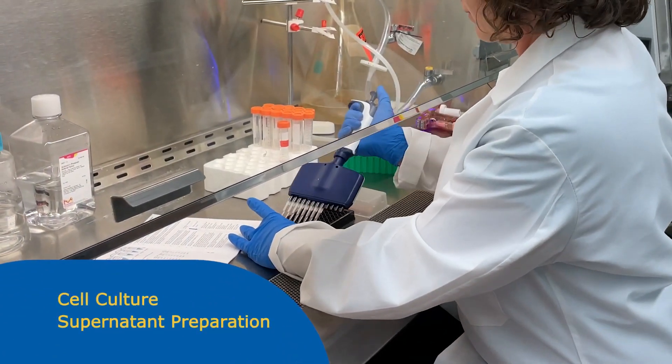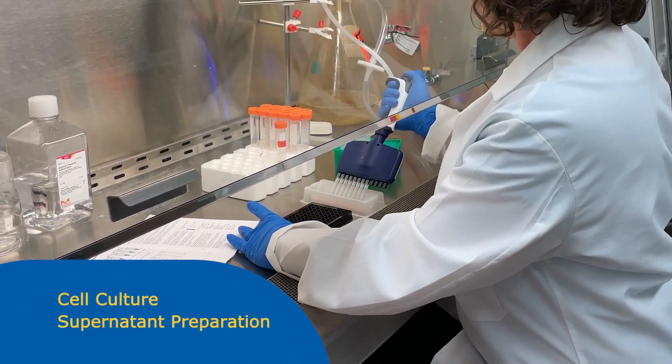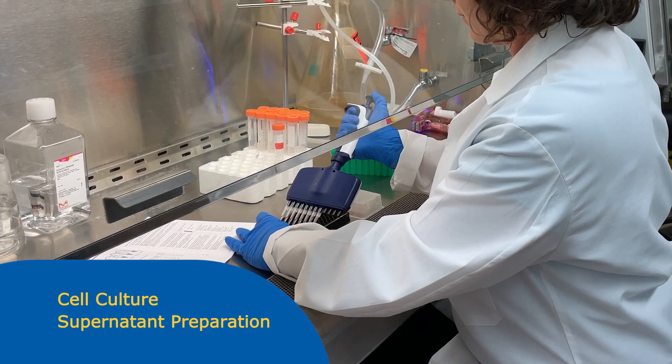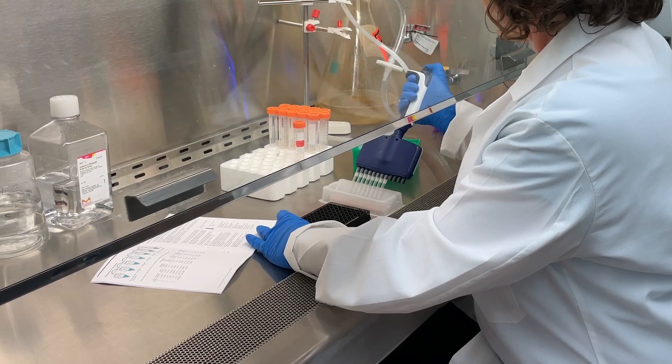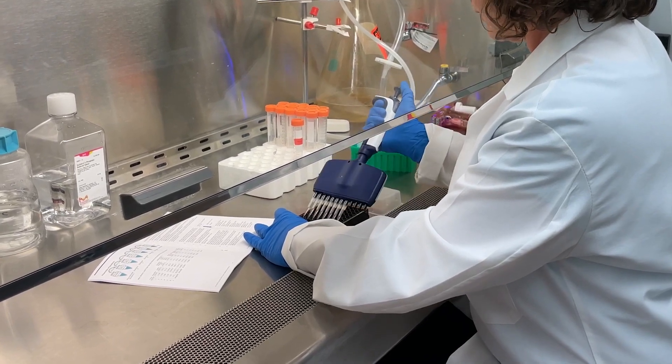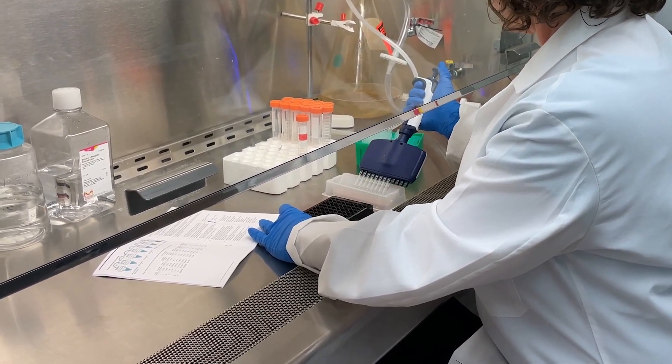Cell culture samples should be centrifuged to remove debris and assayed immediately, or stored at minus 20 to minus 80 degrees Celsius until needed. Fresh culture media should be used as the matrix solution in the blank, standard curves, and control wells.